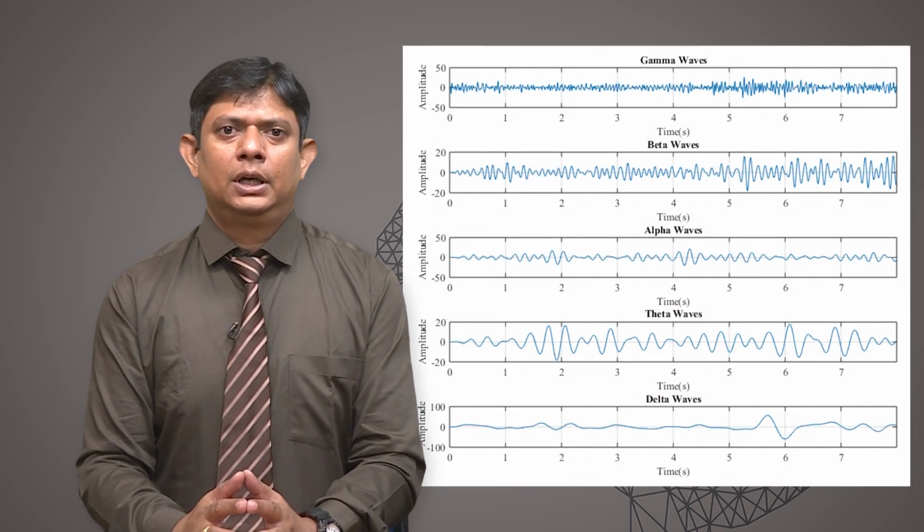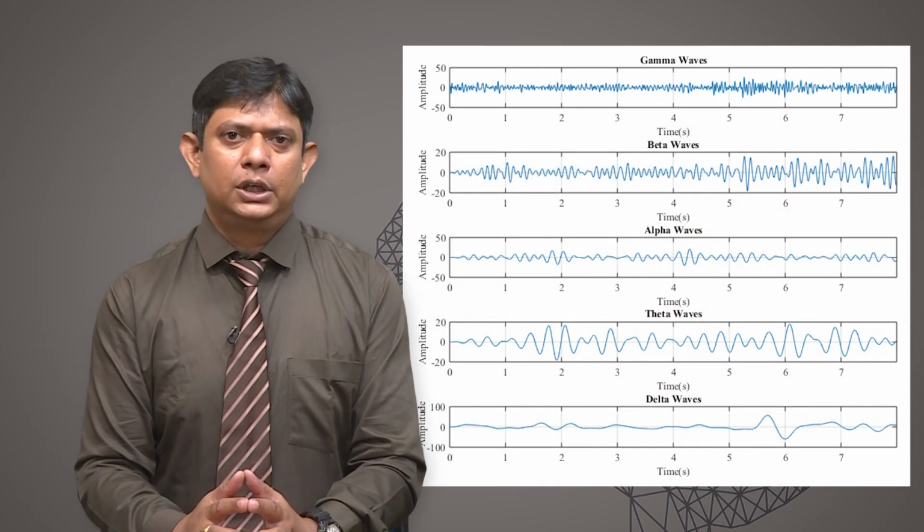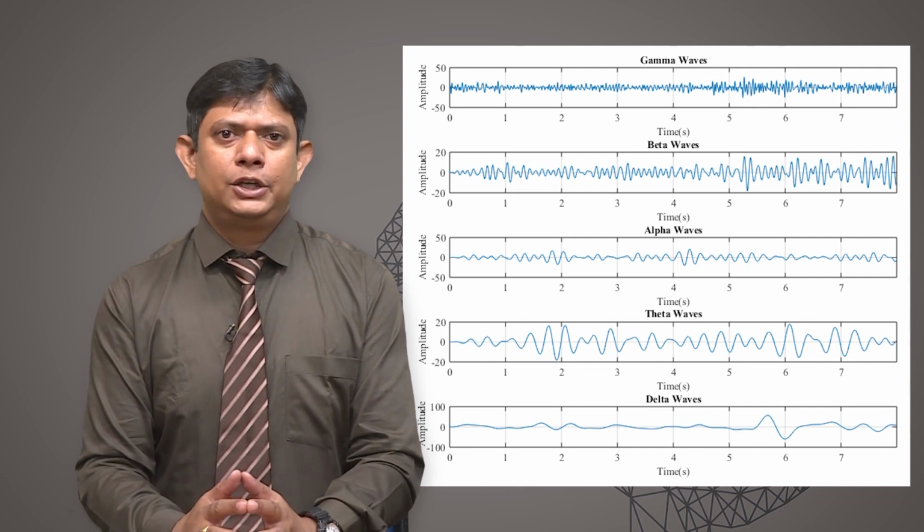Abnormal frequency patterns can indicate neurological disorders. Amplitude also plays an important role in diagnosing. Amplitude reflects the magnitude of neural synchronization or desynchronization. Larger amplitude indicates more synchronized firing of neurons, while smaller amplitude signifies more desynchronized activity. Higher amplitude in a certain frequency band can signify distinct cognitive processes. For instance, during focused attention, beta wave amplitude tends to be higher.